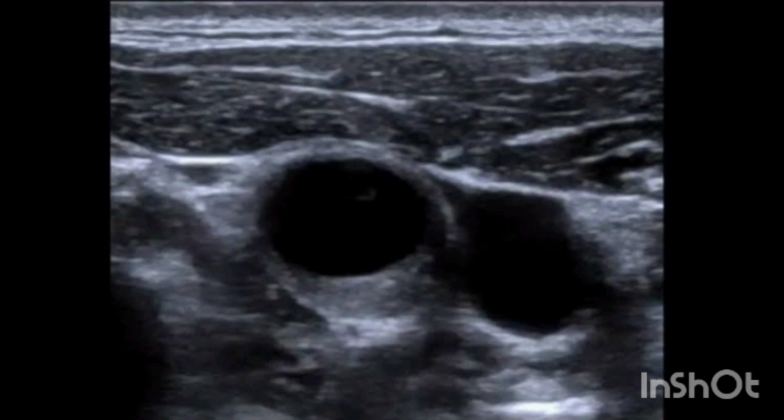In today's video, I'll be diving into the fascinating world of vascular imaging, specifically the ultrasound evaluation of plaque in the common carotid artery. Ultrasound is a non-invasive real-time imaging technique that is invaluable in the evaluation of vascular health. The common carotid artery, one of the major vessels supplying blood to the brain, is a key area where plaque formation can indicate the risk of stroke and other cardiovascular events.